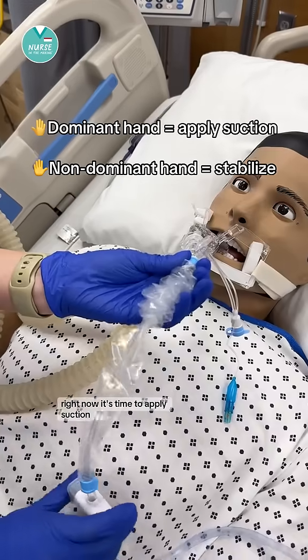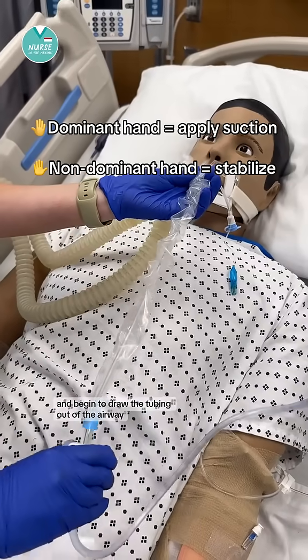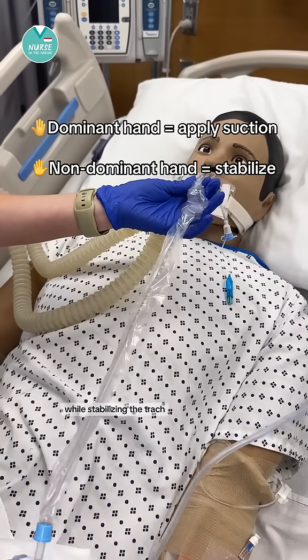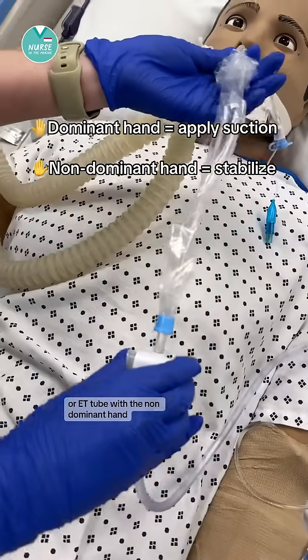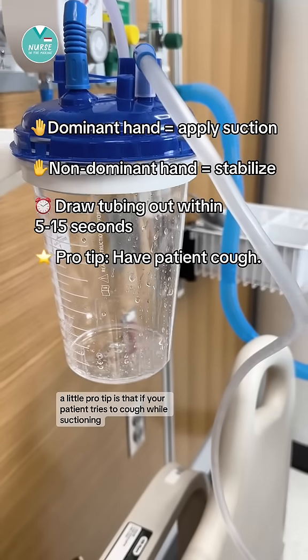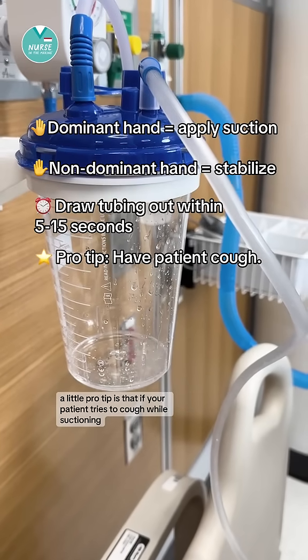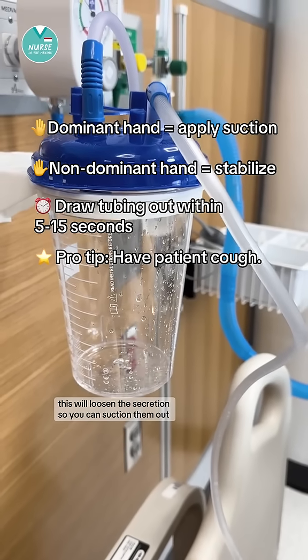Now it's time to apply suction. Press the thumb valve with your dominant hand and begin to draw the tubing out of the airway while stabilizing the trach or ET tube with the non-dominant hand. Draw the tubing out within 5 to 15 seconds. A pro tip: if your patient tries to cough while suctioning, this will loosen the secretions so you can suction them out.